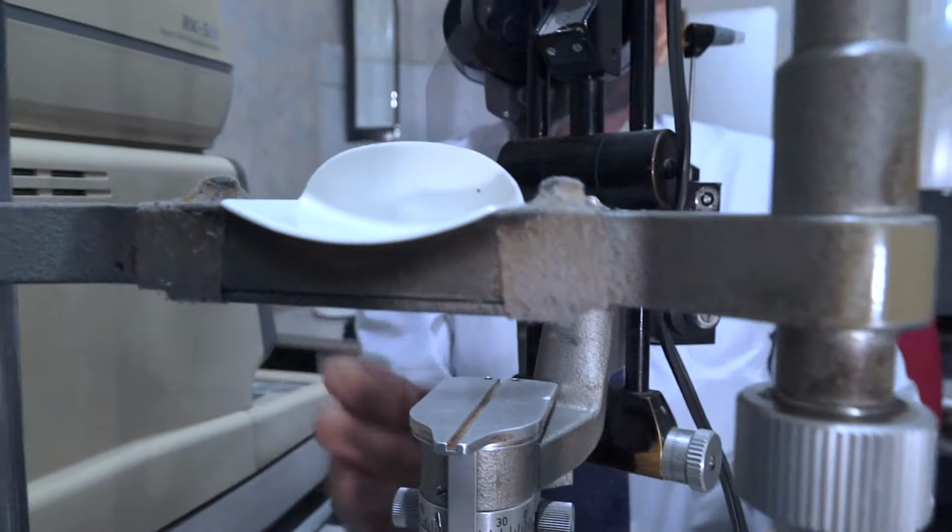We can examine the other eye while the patient is fixating. And then when we are not using this fixation target, it can be moved to one side of the patient. These are the parts of the slit lamp which we can use.